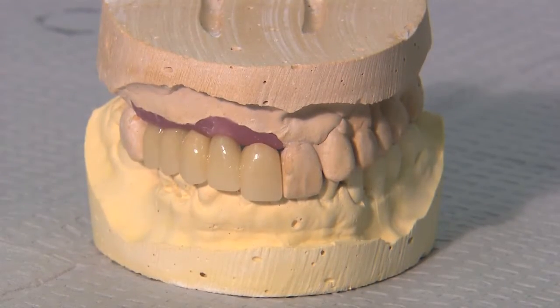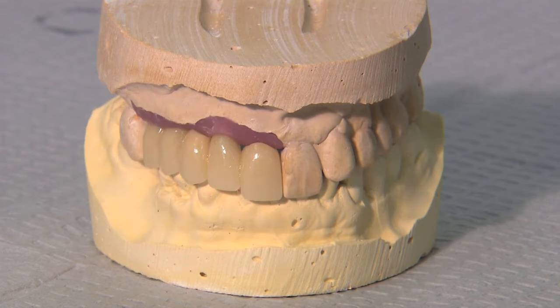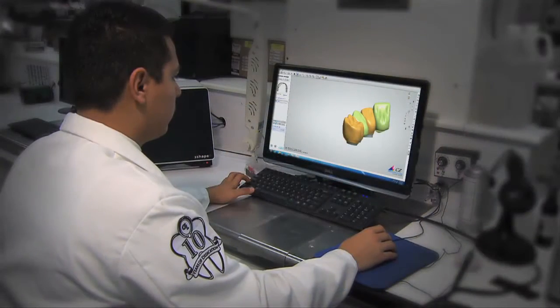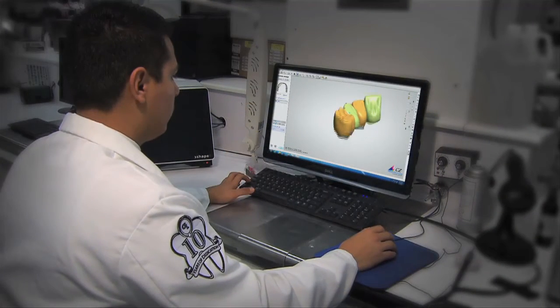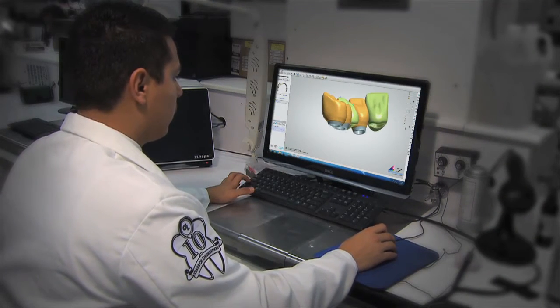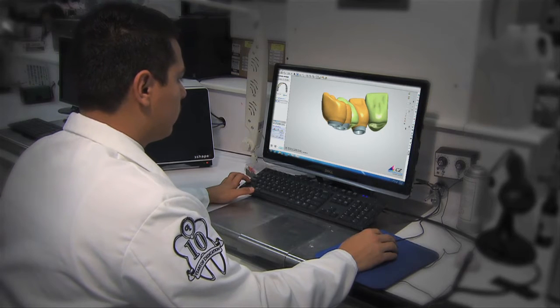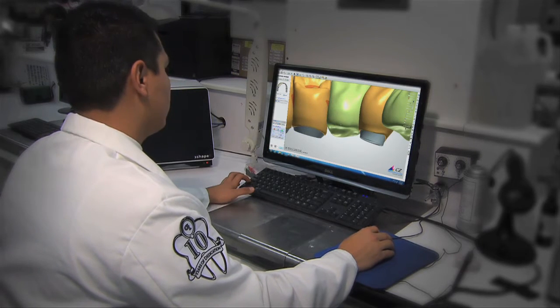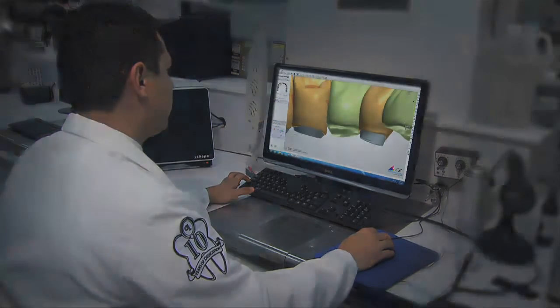All of the steps taken to produce this five-unit BioTemps bridge help ensure an ideal prosthetic outcome for the final restoration. The versatility of CAD-CAM technology and layered PMMA makes this approach suitable for single-tooth, multi-unit, or full-arch cases.